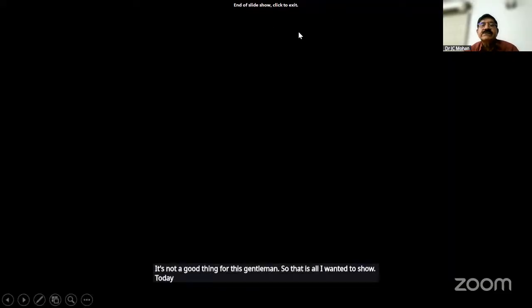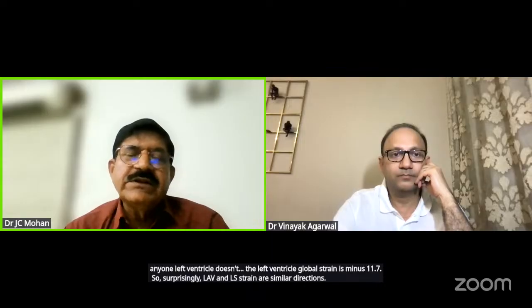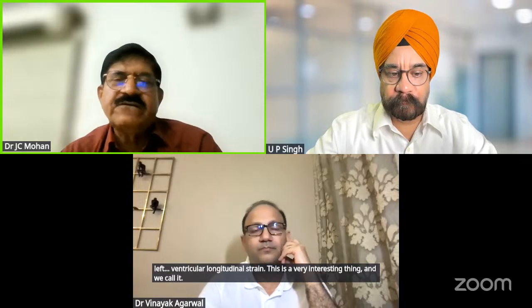Today, I was focusing on left atrial reservoir strain rather than anything else, and I thought of even asymptomatic individuals with diastolic dysfunction. So he is grade 2, and he also has, of course, a very poor prognosis because the left atrial reservoir strain is 12% and the left ventricle global strain is -11.7. So surprisingly, LA and LV strain are in similar directions. Normally, the ratio is actually 2 to 1. Left atrial reservoir strain is twice the ventricular longitudinal strain. So this is a very interesting thing, and we call it dissociation of longitudinal strains. Dissociation of atrioventricular longitudinal strain is an important marker of prognosis.